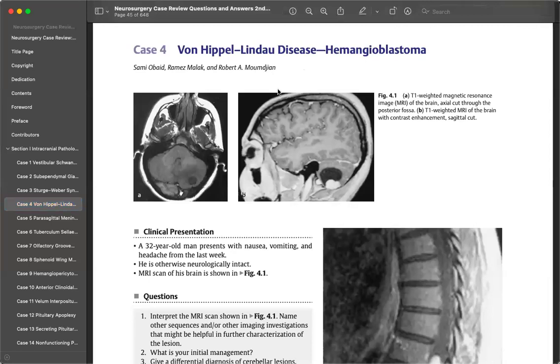The MRI scan shows an enhanced T1 weighted image. It shows a cystic lesion in the left cerebellar hemisphere, approximately 1 cm in diameter with limited edema and little mass effect on the fourth ventricle. Although not shown on this image, there was no evidence of hydrocephalus.